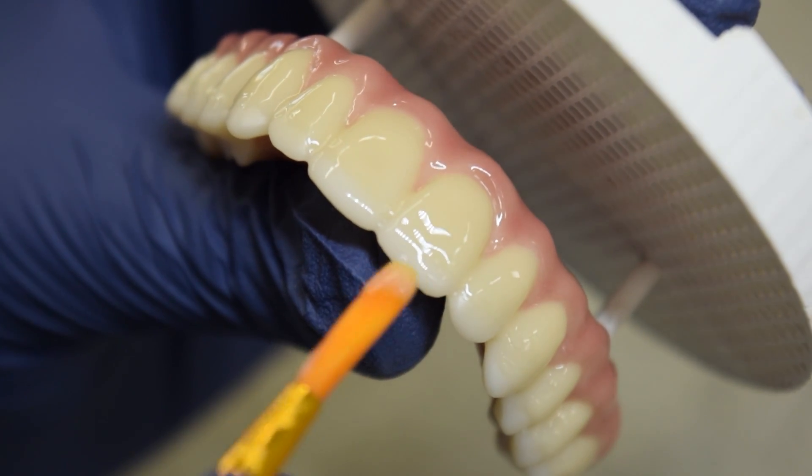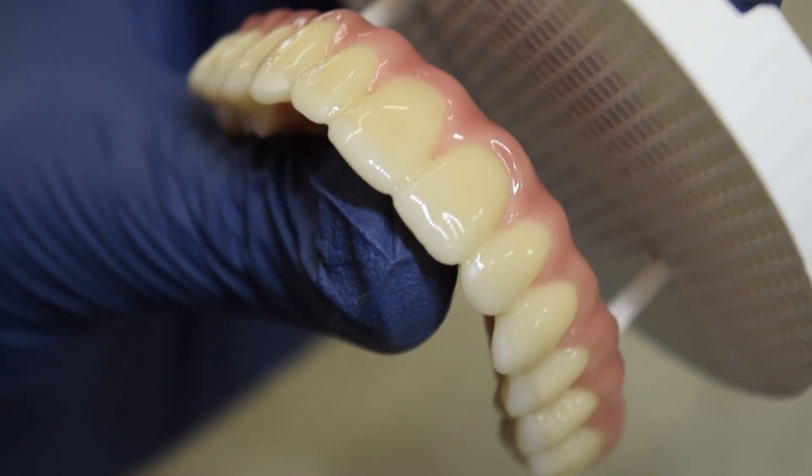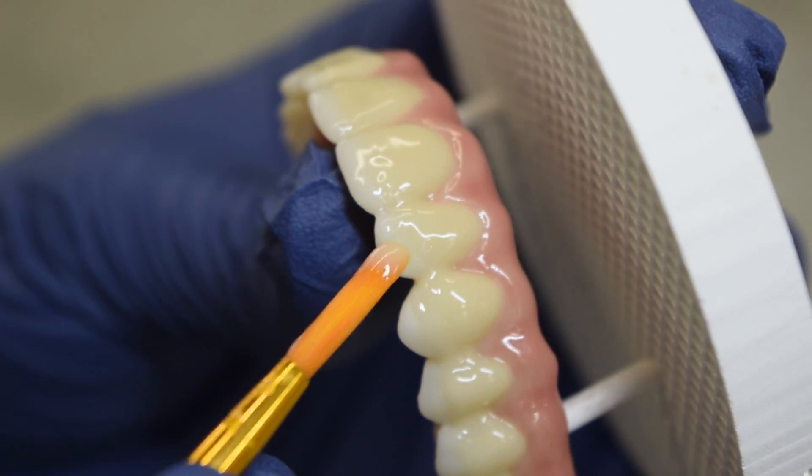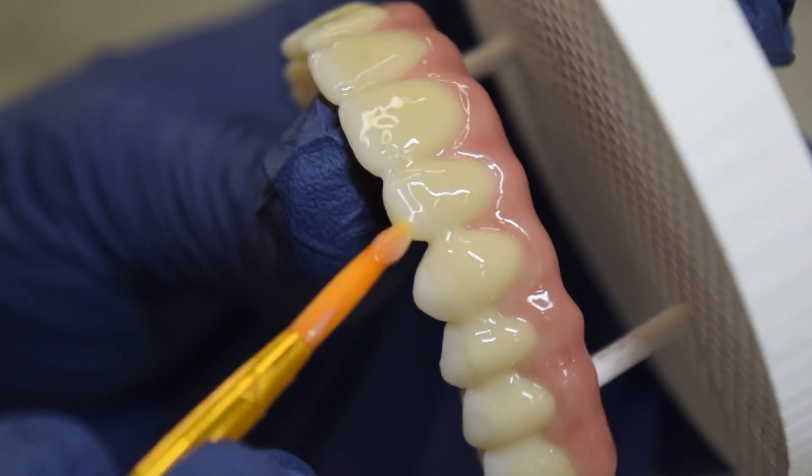Teeth naturally have varying degrees of translucency, allowing more light to pass through the bottom part of your teeth. Using two types of stain helps give the artificial teeth a similar effect.